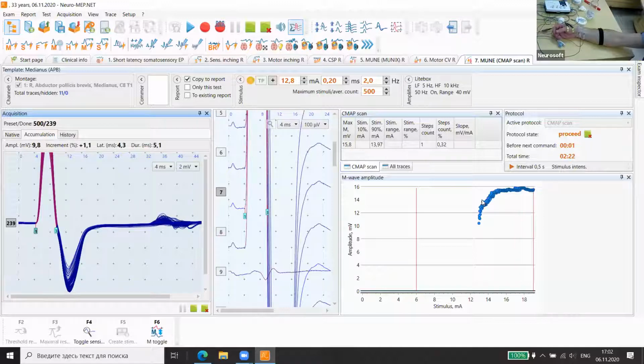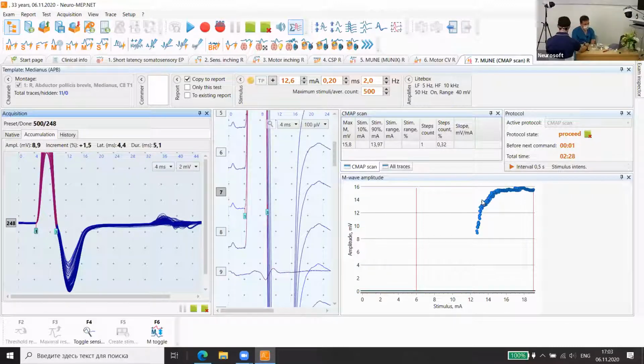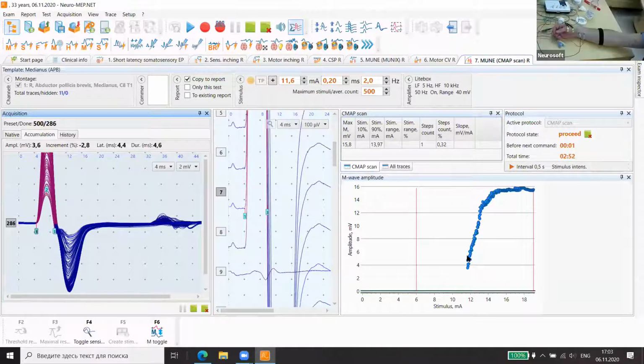Usually it takes about 5 minutes. Now we can see this main slope of the decreasing without big intervals. It's absolutely normal. We get a very nice curve without any problem.